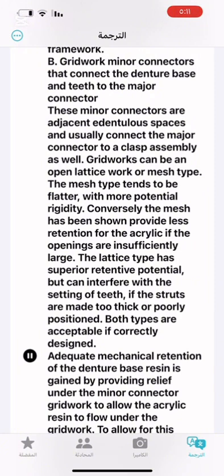Ideally, a minor connector should not contact the teeth gingival to the height of contour. If a minor connector fits tightly against an abutment below the height of contour, a wedging force may be created during functional movements of the framework. This wedging can result in increased tooth mobility. Alternatively, it may be difficult to seat or unseat the framework.